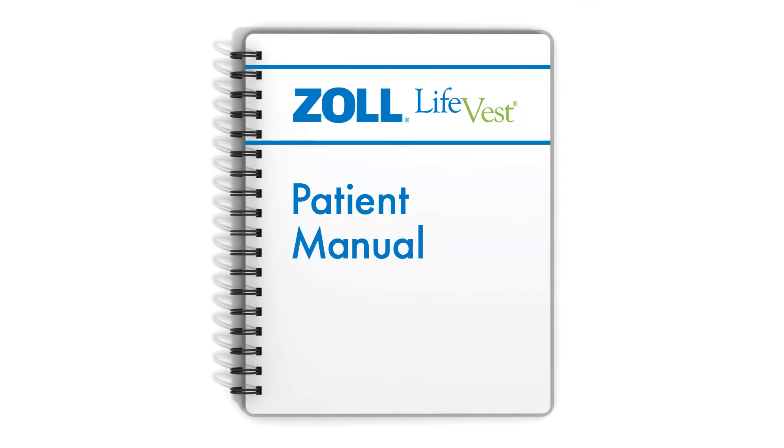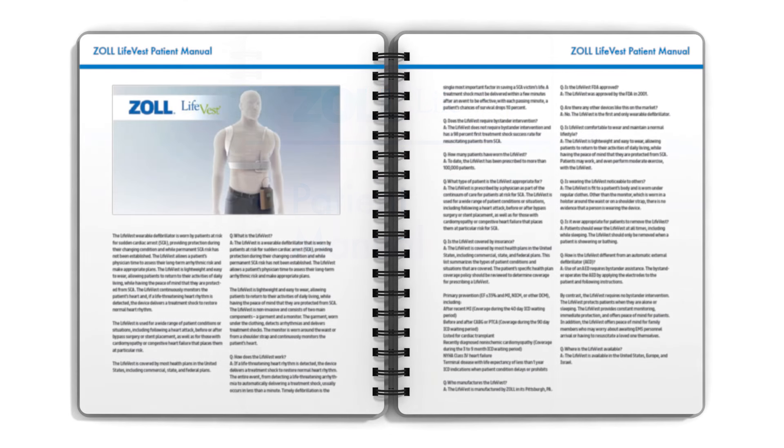It is very important that you wear the Life Vest as instructed and download data from your Life Vest device regularly, at least once a week. If your device has not sent data in more than seven days, you will receive a prompt when you insert the battery, instructing you to send data manually with a message on the monitor saying: time to send data. For more information on how to download and send data to Zoll, please refer to your patient manual.